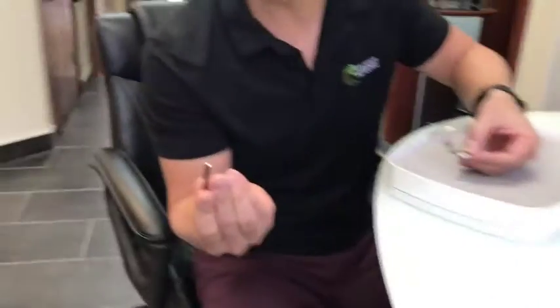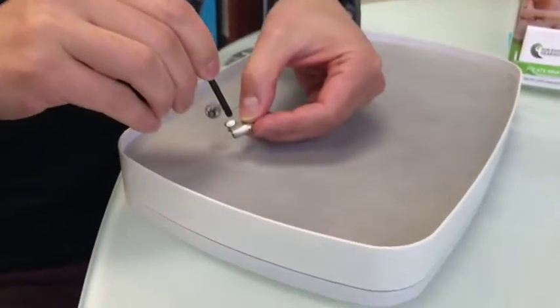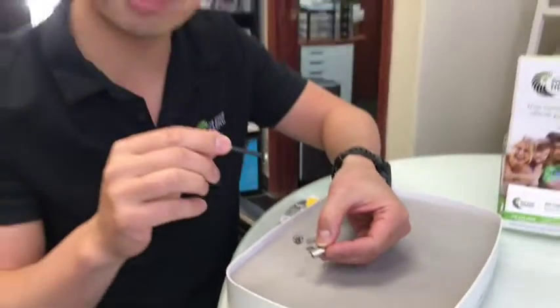The magnet is right on the end of that tip. What you're going to want to do is just reach over, touch the top of it, and — like magic — it's out.